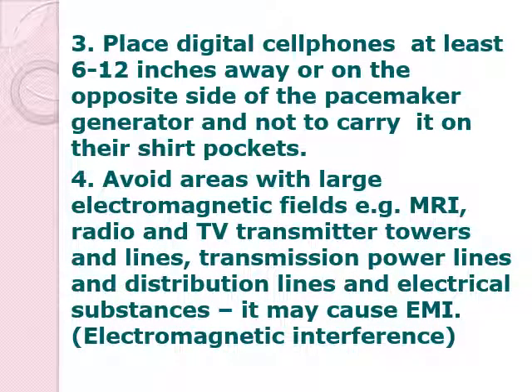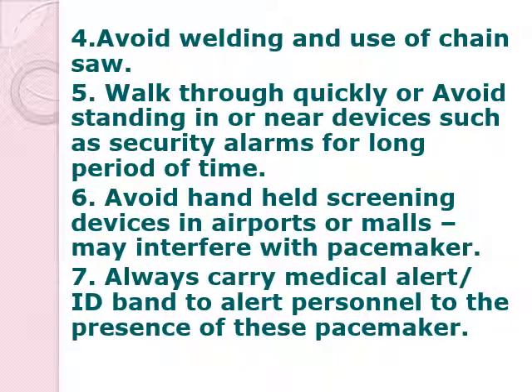Then you have your digital cell phones. It should be 6 to 12 inches away or it should be on the opposite side of the pacemaker. It is not supposed to be carried inside your shirt pockets. Okay, areas with magnetic fields such as your MRI, such as your radio, TV transmitter, towers, lines, okay, should be far from your pacemaker because it may cause your electromagnetic interference or your EM. Then welding and use of chainsaws not recommended because of the vibratory effects.